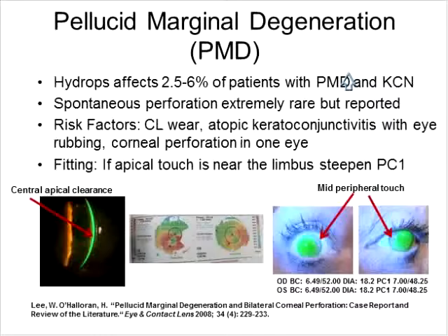I've had about 3 now, and as far as the fitting window, I think once the epithelial defect has resurfaced, it really is up to the surgeon if they're comfortable with starting the fit, because in essence you're jumping over the cornea, so there's no harm there.